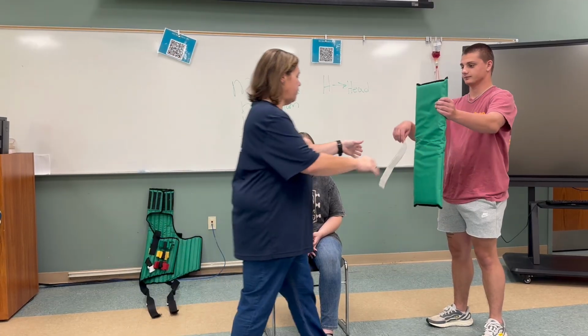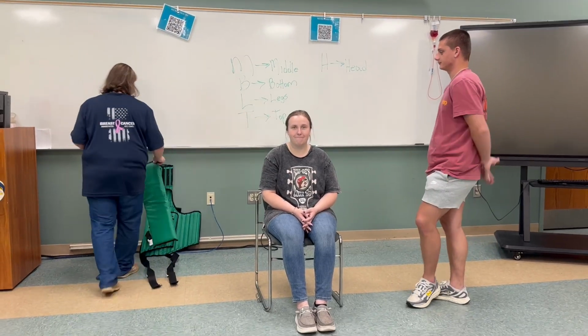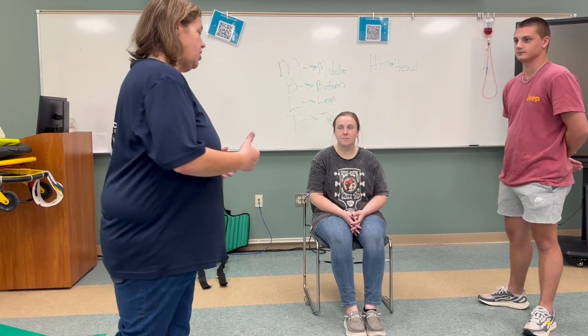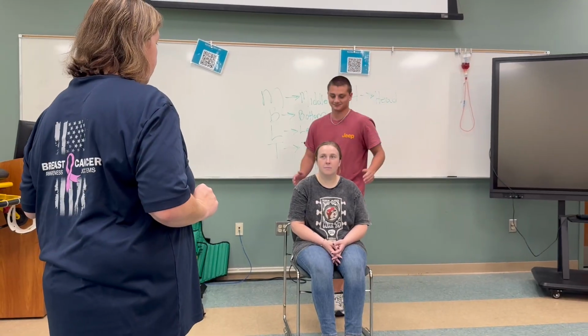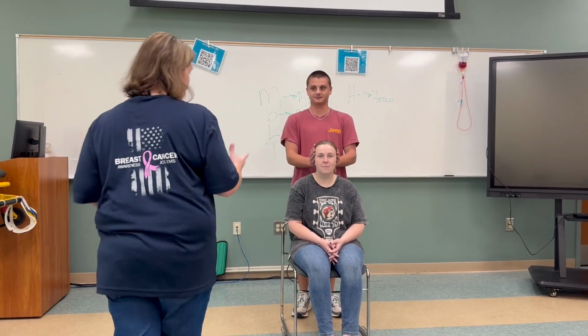So I will take this from you. So we will say that Miss Zoe here was in a motor vehicle accident, and she is sitting in the driver's seat or passenger seat of the vehicle. A good way to practice this is when you approach a patient, have them always look straight at you so they don't turn their head. And you will instruct them, ma'am, my partner is going to come in behind you and hold your head in place. Okay? And I will instruct my partner to please hold manual cspine stabilization as he's holding.